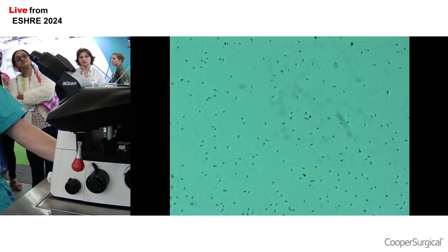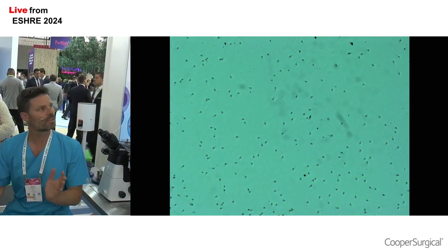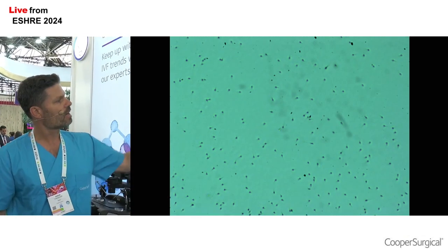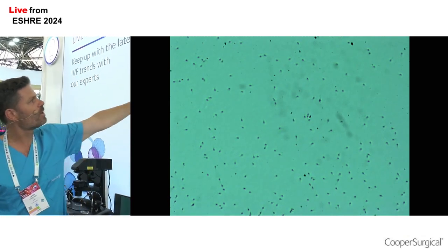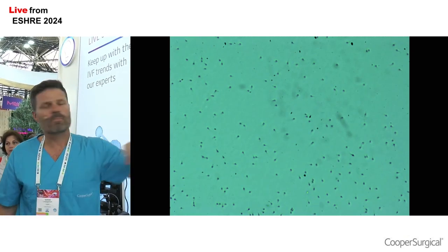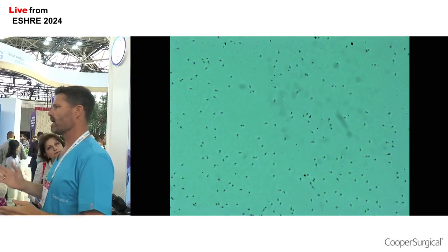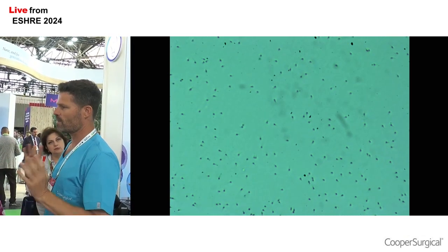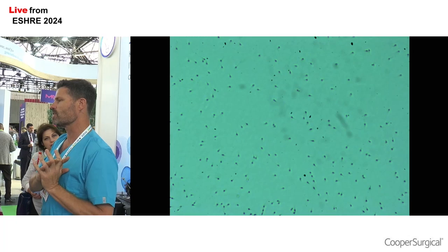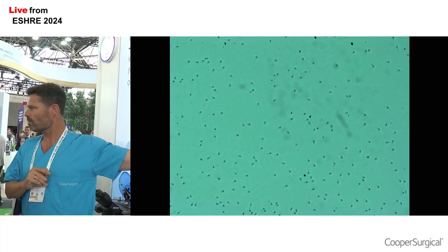So this is within that area, that zone of where the hyaluronic acid is. And hopefully everyone can see, we have some sperm which are swimming and are not bound, okay? This dish I actually prepared about 30 minutes ago to make sure that everything is ready for the demonstration. So what we can see now, there's actually quite a lot of sperm which are bound.